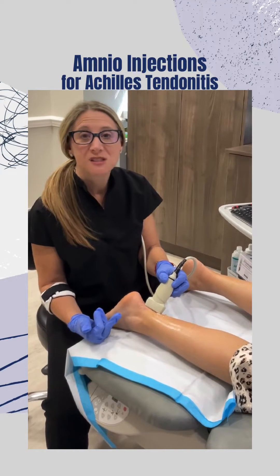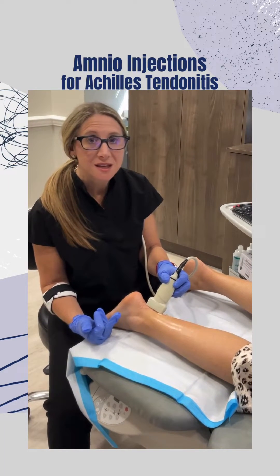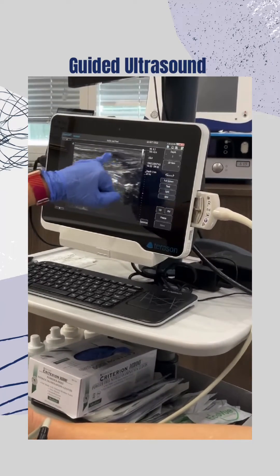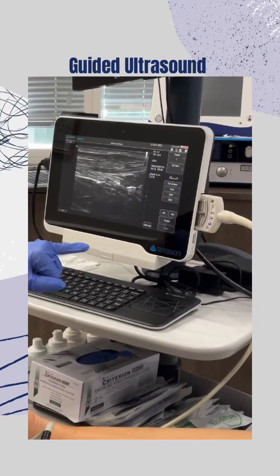Patient presented with some tearing and swelling within the Achilles tendon. This is the Achilles and it is thickened, with some darkness showing some swelling throughout the tendon.